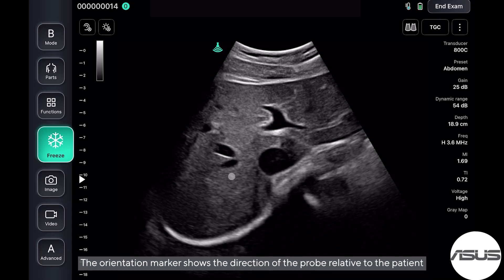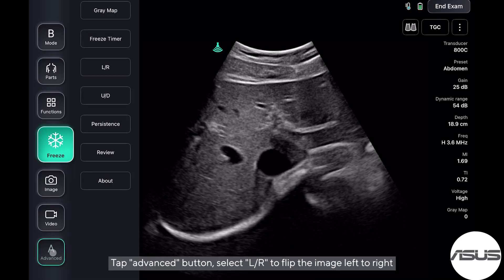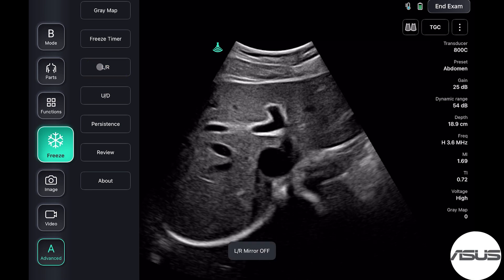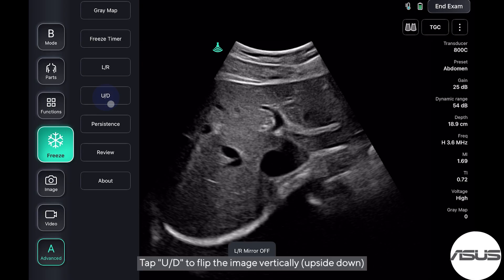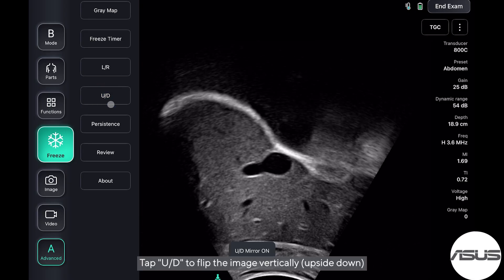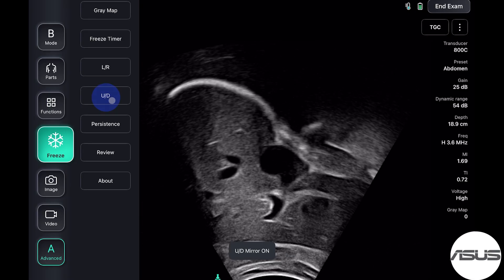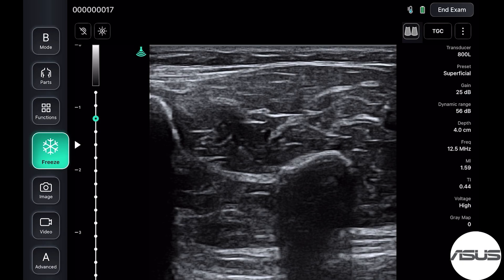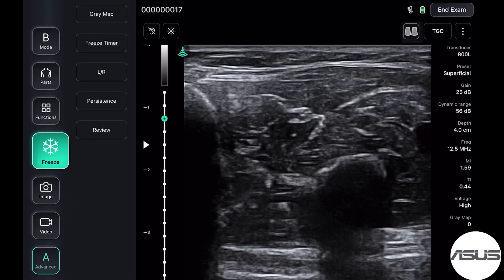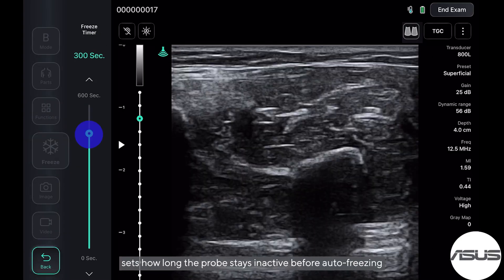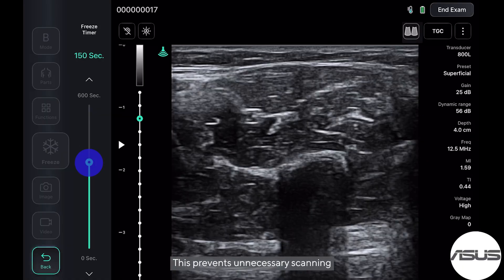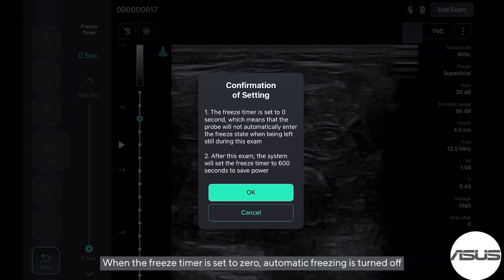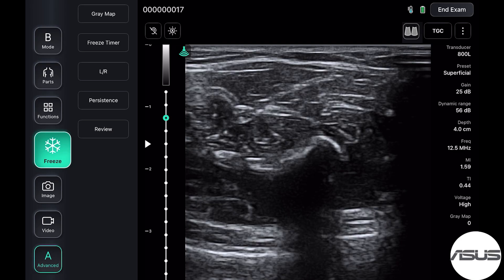The orientation marker shows the direction of the probe relative to the patient. Tap the advanced button, then select LR to flip the image left to right. Tap UD to flip the image vertically, upside down. Tap the advanced button, select freeze timer, and set how long the probe stays inactive before auto-freezing. This prevents unnecessary scanning, reduces wear, and avoids unwanted images. When the freeze timer is set to zero, automatic freezing is turned off.